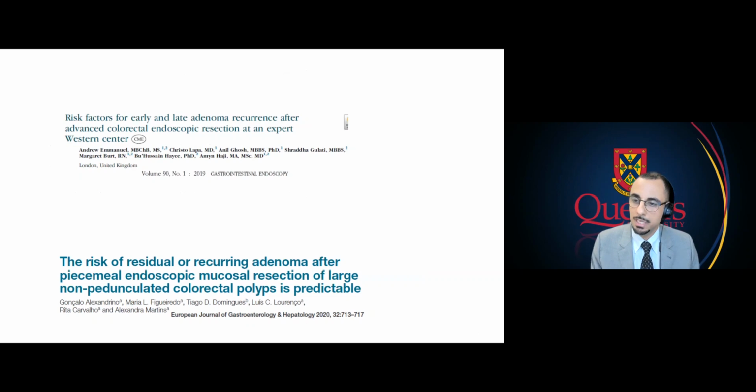They used hybrid ESD, which is kind of in between EMR and ESD, and it's thought to have a decreased recurrence rate afterwards. And they had an overall 15% recurrence rate. The group from Portugal had about 160 patients in their series, and the recurrence rate was about 11%. And again, they used adjunctive measures such as burning the edges, either with a forceps or argon plasma coagulation.